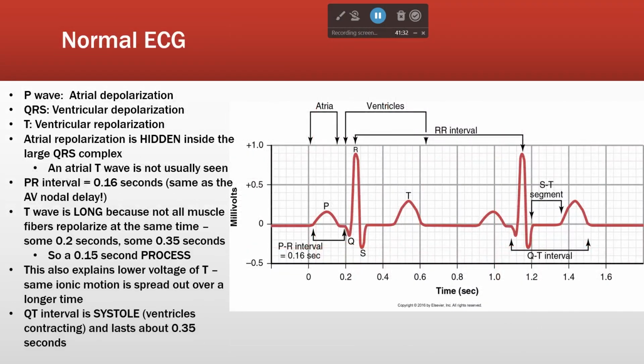I just want to talk about the normal first, okay? When we hook a patient up to an electrical meter, this is the pattern that we get, at least if we do it in a systematic way. So we have no change, no electrical activity. Then we have an upward deflection, that's the P wave. The first upward deflection reflects atrial depolarization, right? So the atria depolarize. After they depolarize, they contract. So it means that after the P wave, the atria are contracting.